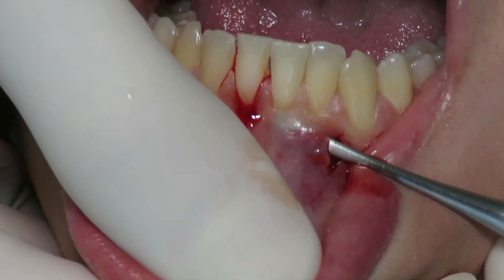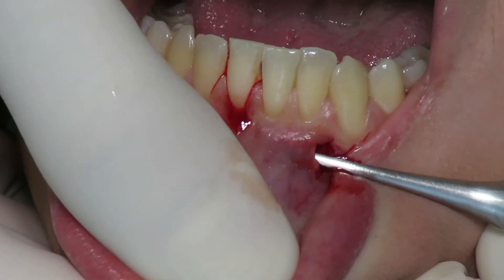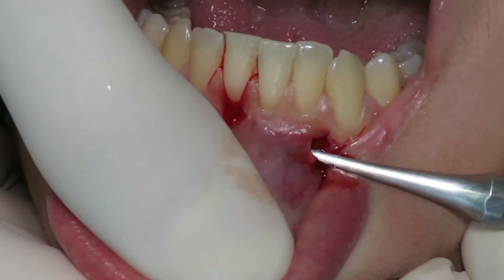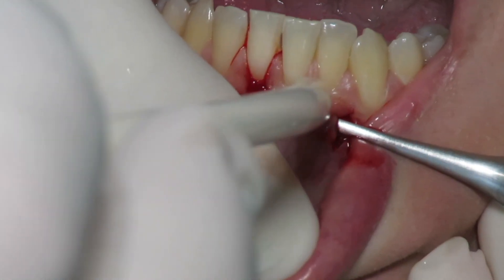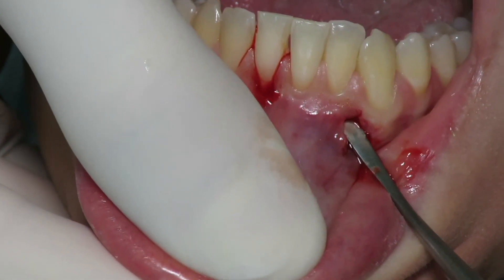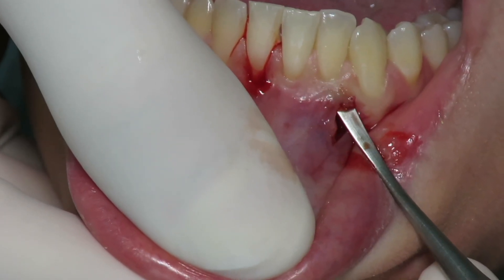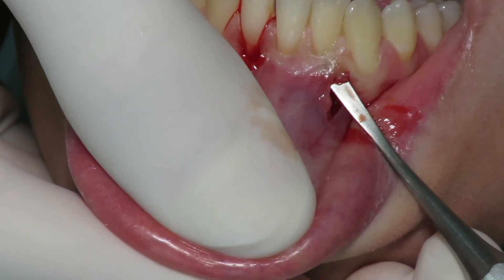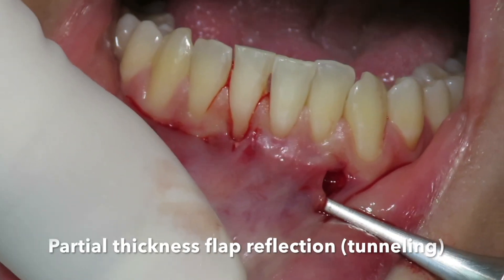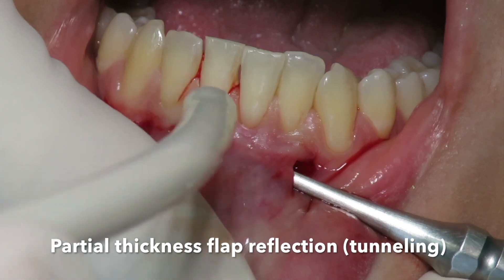The gum was extremely friable and extremely thin — the gingiva was very thin in this case. So we dissect properly the mesial and the distal parts of the recession. This is going through the mesial, which forms the tunnel.